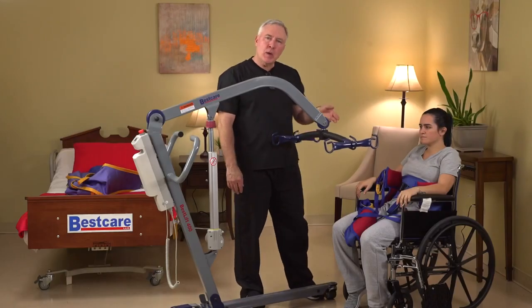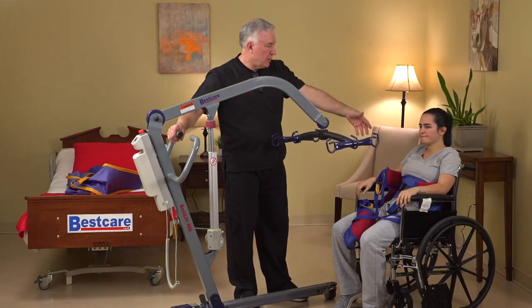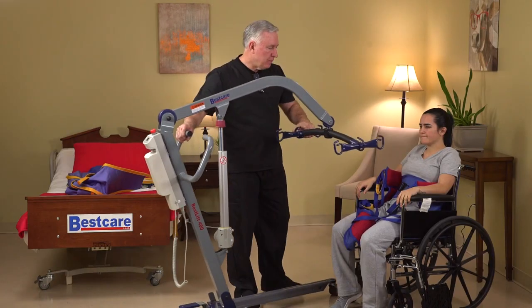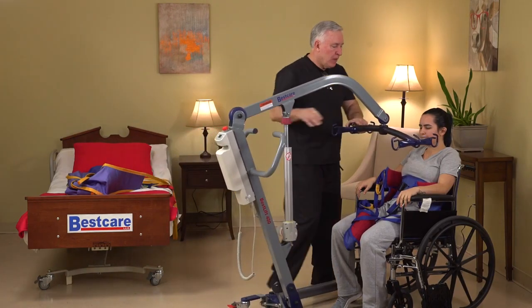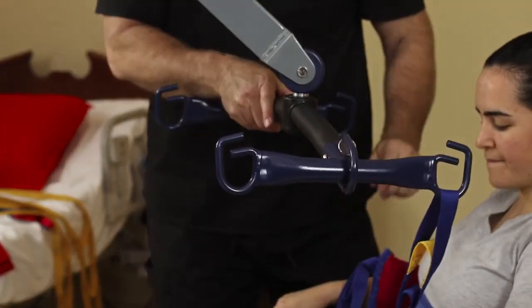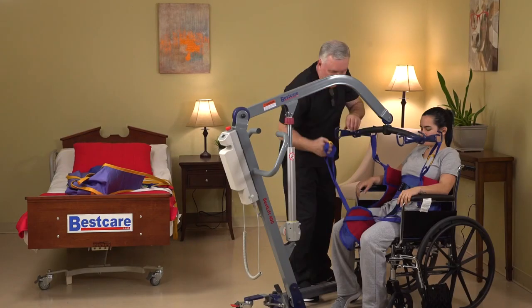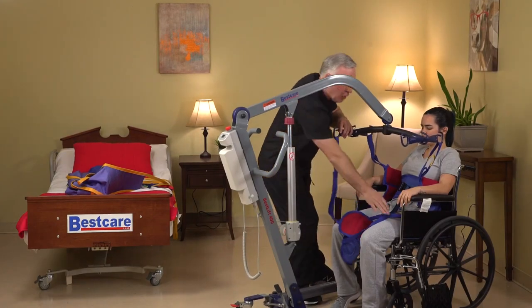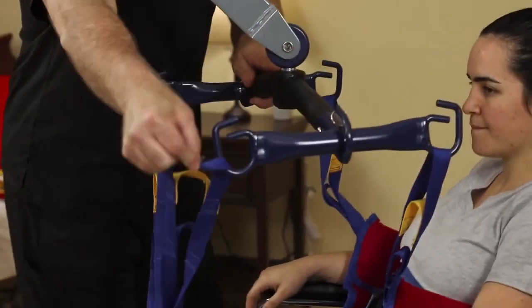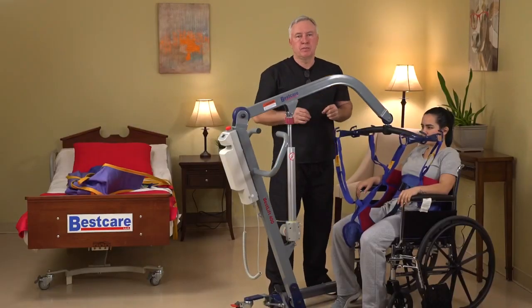Now it's time for me to show you how to hook up the Sani sling to the new 6-point spreader bar. The Sani sling is in position on the patient. Approach the patient with the lift. Take the shoulder loops, connect them to the first hooks, and the leg loops to the hooks that are closest to the lift. Now we can transfer the patient from the wheelchair to the bed.